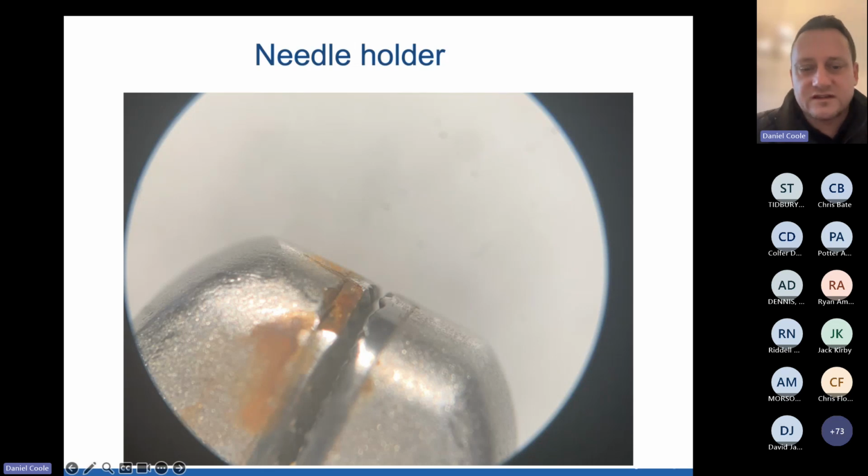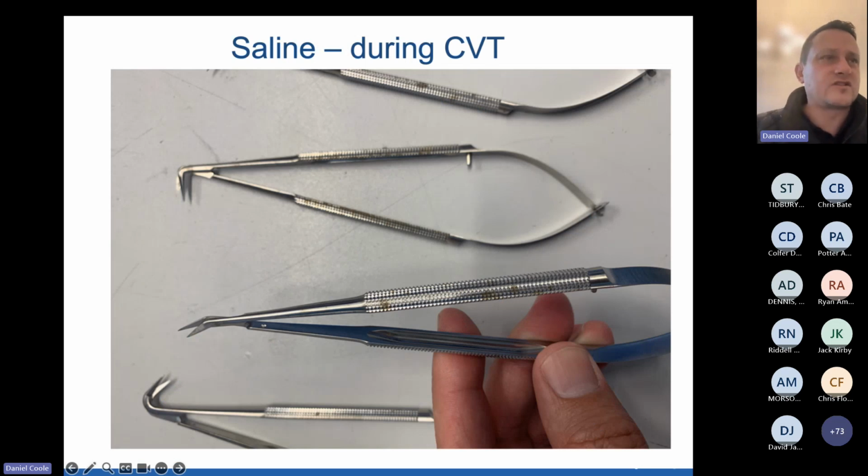Free irons released, as we mentioned earlier, that as it likes to do, and you have this rust. So it's important to inspect anything which doesn't look right. It might be worth a look under magnification, because there might be another story to be told there.